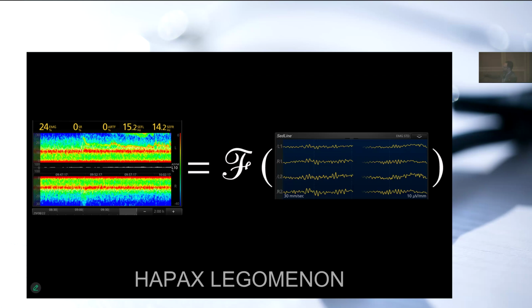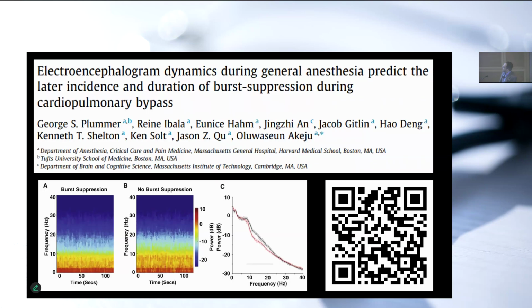This is the only slide like this. Essentially, one piece of EEG can be transformed into one vertical slice through this longer map of frequency information. And it gives us a very, very useful tool for two reasons. One, with a snapshot view of this, I can tell you that this is what the EEG looks like. And with a horizontal view, I can say it's looked like that for a long time, and it is still looking that way. So with that tool in mind, which is important, we can start to look at some of the contemporary research in this area.